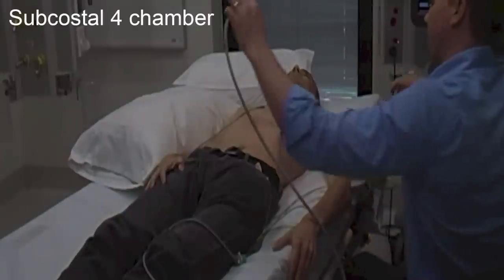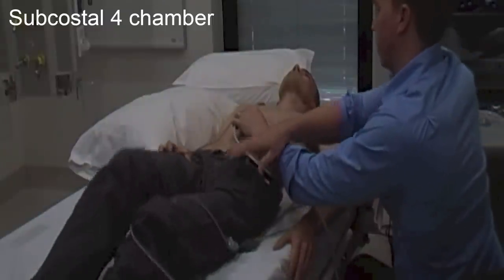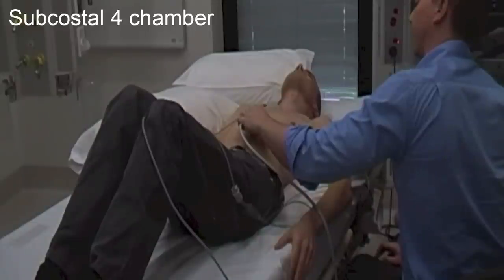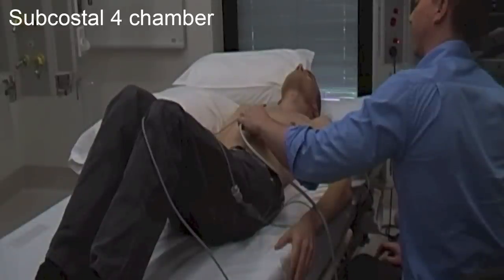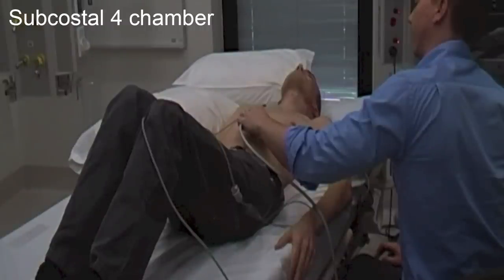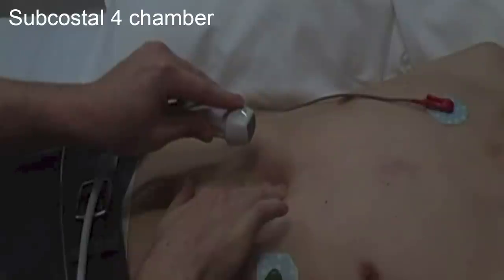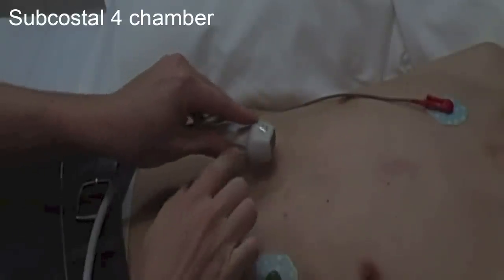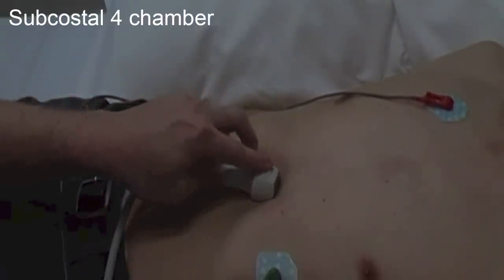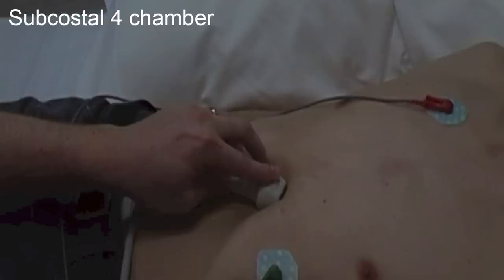For the subcostal four chamber, position your patient in the supine position and try to get them to relax their abdominal muscles. You can achieve this by ensuring that the patient's head and neck are completely relaxed and flat, with their hips bent and knees flexed. Hold the probe in between your thumb and index finger, but change the position of your hand to being above the probe so that you can apply pressure against the abdominal wall. Place the probe in the sub-xiphoid region with the probe marker towards three o'clock.